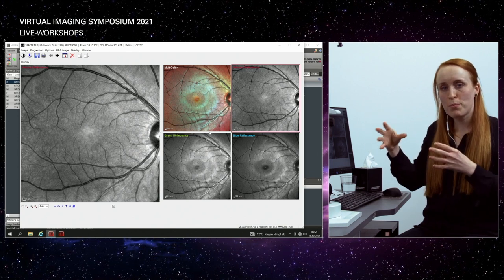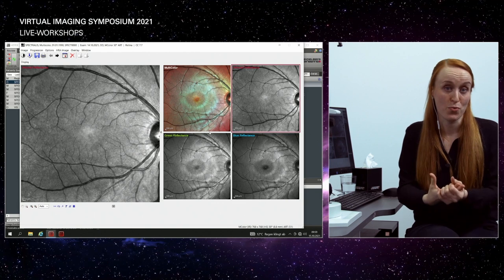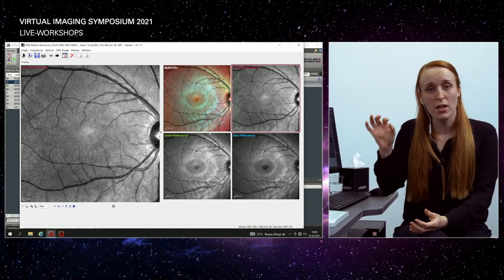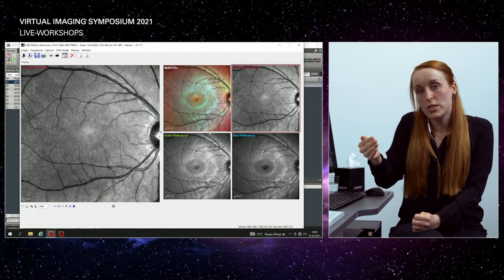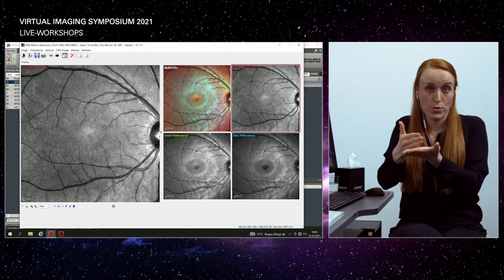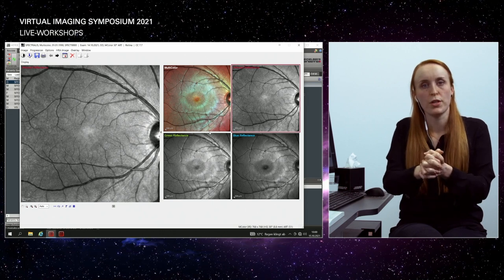Why am I telling you? All the preparation you have to do for the measurement is, first of all, checking your focus and finding your perfect focus in the infrared image, and then just do a defocus of minus one diopter to get all of those three wavelengths imaged in a perfect way, okay? And this is what we are going to do first.